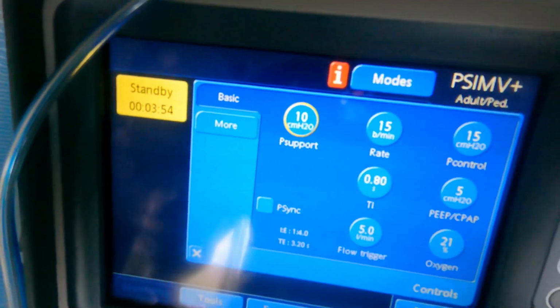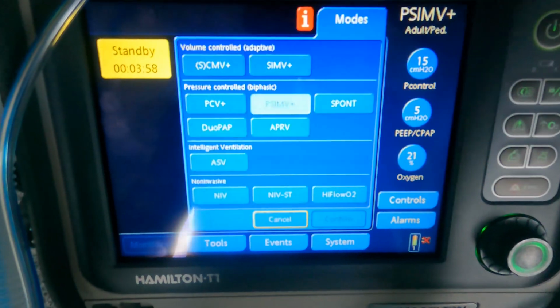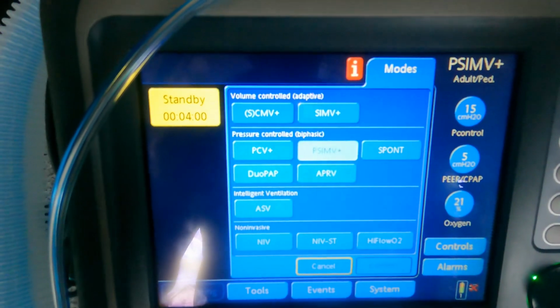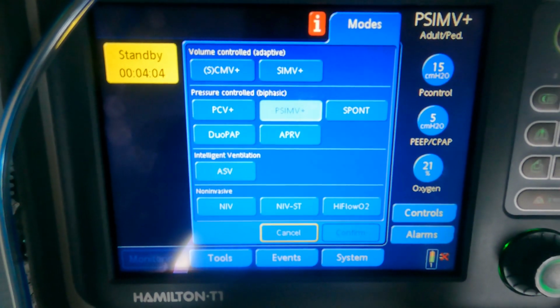That's really the main differences. Otherwise, it's just being familiar with the protocols, but I just wanted to review how to find these different modes, and we can discuss more about what the actual differences are when we do our skills checkoff.